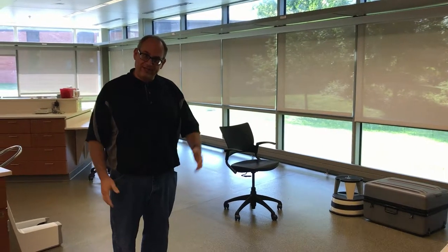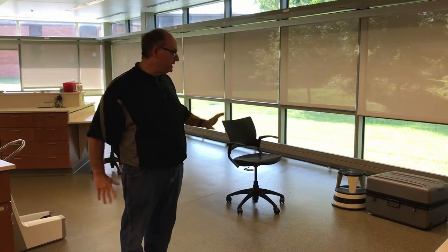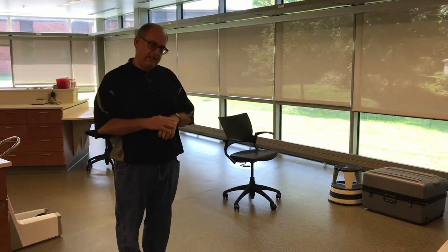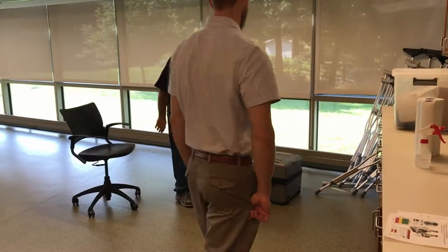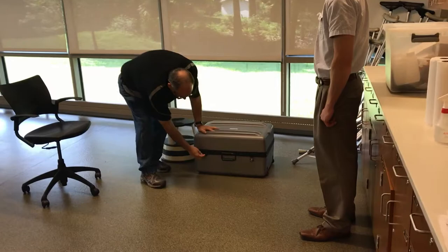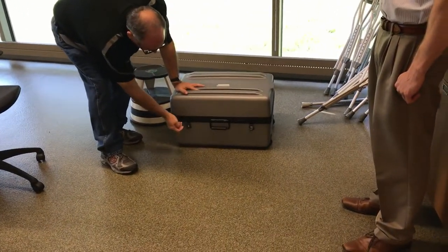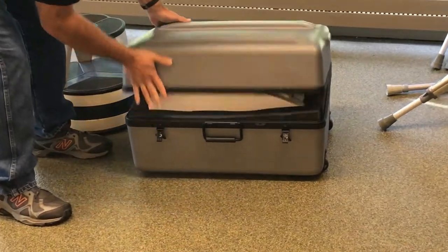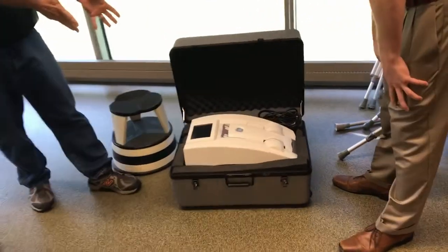This is an informal video on how to use the bone density machine. We're going to start with how to set it up. Normally when you take it to an event it's going to be in this hard shell case. It has some latches that have to be twisted — you open and twist and it falls off — do that on both sides. Open it up and there is the bone density machine.